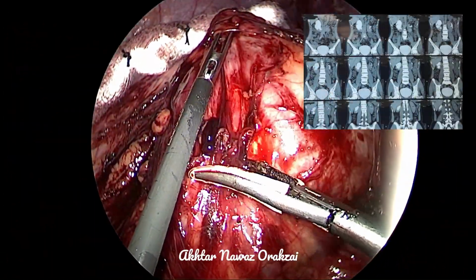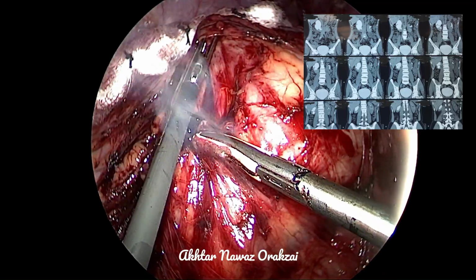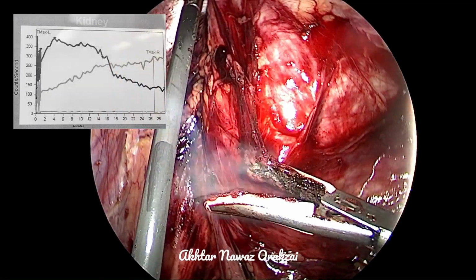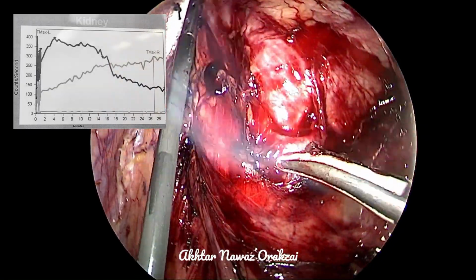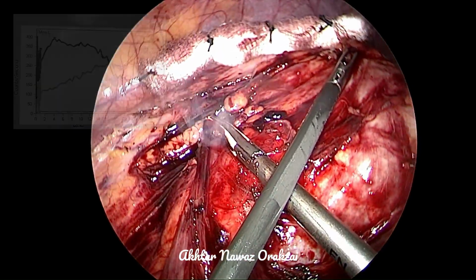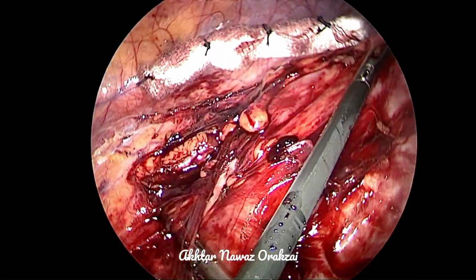So we have mobilized the colon, we have lifted the liver, retracted it, and we are dissecting the pelvis first, instead of going for the ureter, because the ureter will be placed medially.